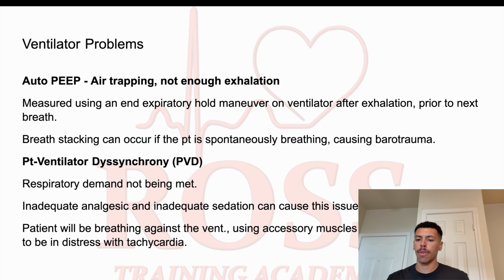All right, so we've talked about the ventilator for a little bit. We've talked about different settings. Now let's go ahead and look at some common problems. And the first one is going to be auto PEEP or air trapping, or just not enough exhalation.